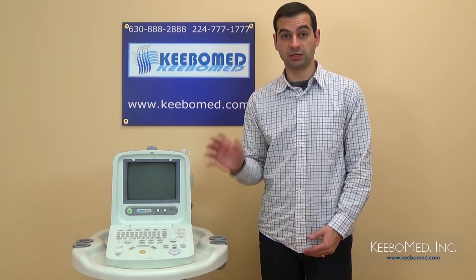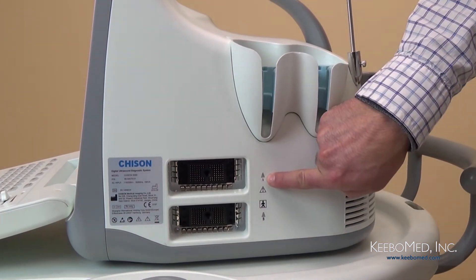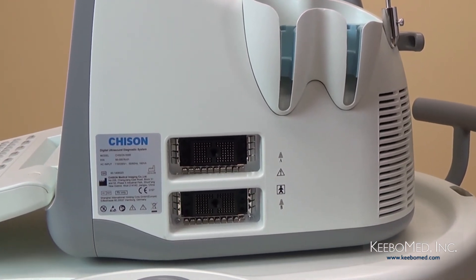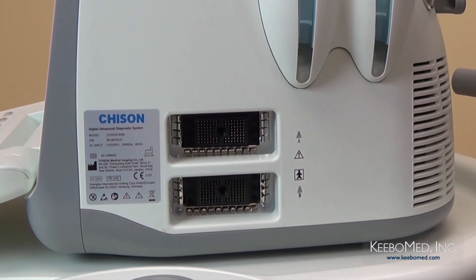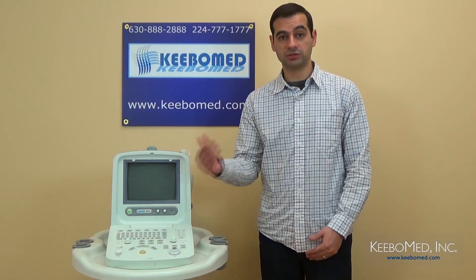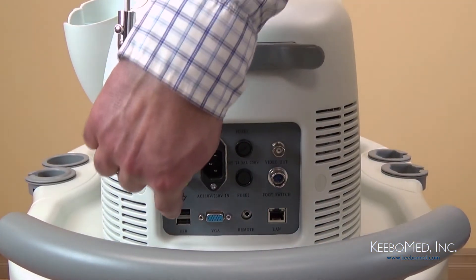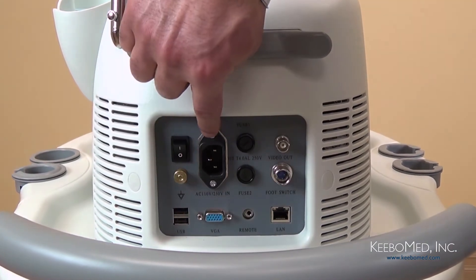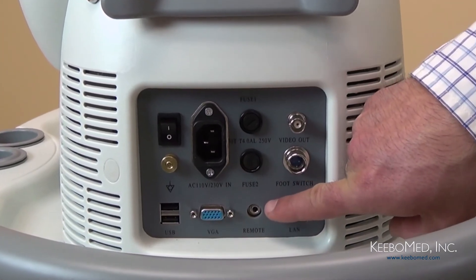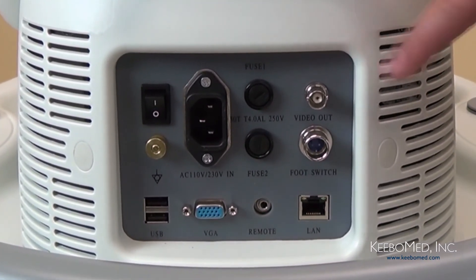Let's take a closer look at the connectivity options and ports found on the 8300. There are two probe ports on the side, which is standard on this ultrasound — many ultrasounds only feature one probe port with an additional available at extra cost, so this is a nice feature that keeps cost down and allows for broader use. On the back of the 8300 are the power switch, two USB ports, the power adapter port, VGA port, a remote port, a LAN port, a foot switch port, and a video out port suitable for a video printer.